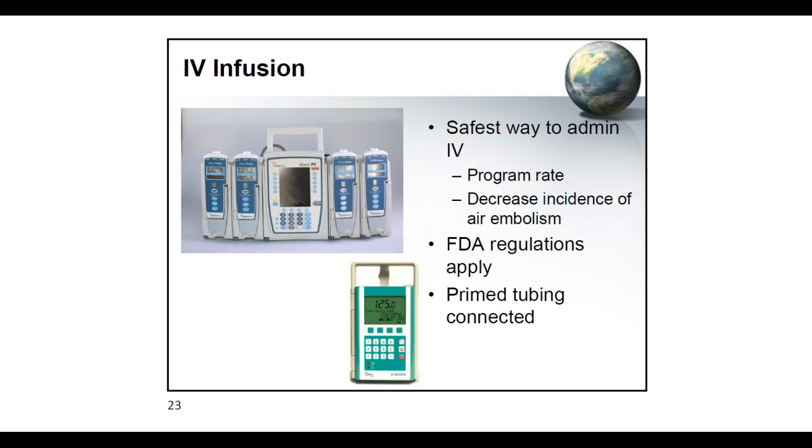If you don't follow the policy and you don't program it, let's say you make it a basic infusion, which you'll learn about down the road, basic infusion basically disregards any sort of guardrails, and you don't specify what medication or fluid it is. Then the machine doesn't know what it is, so it doesn't have a limit as to how fast you can administer it. So again, always use your guardrails, always use the pump.